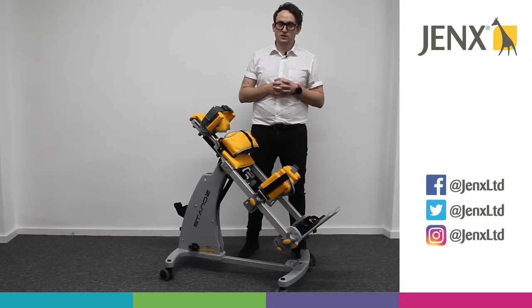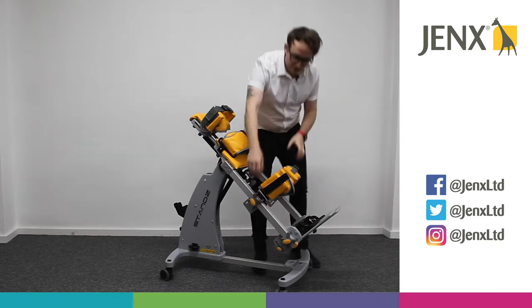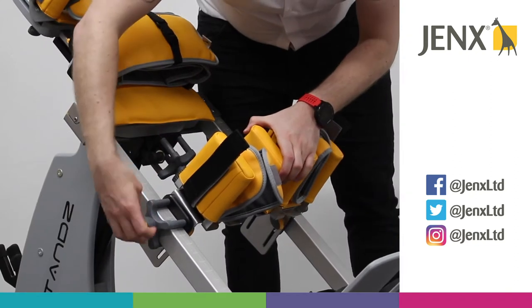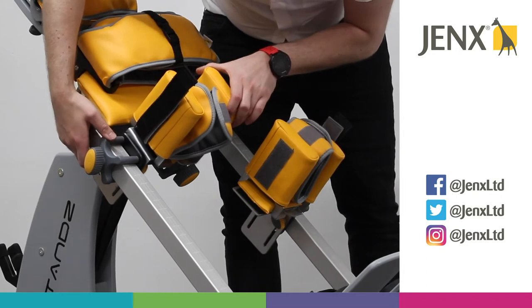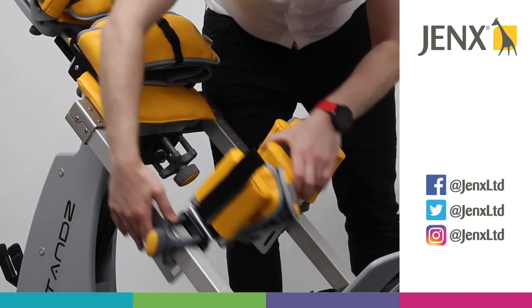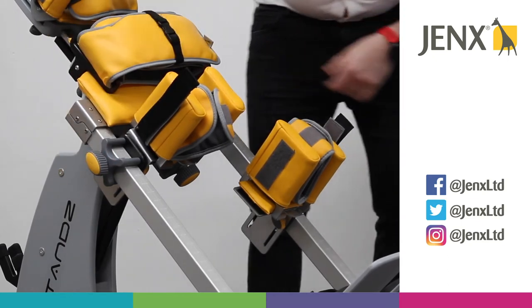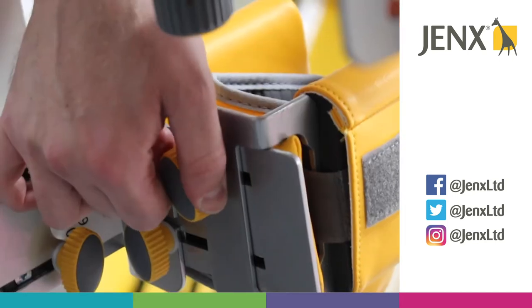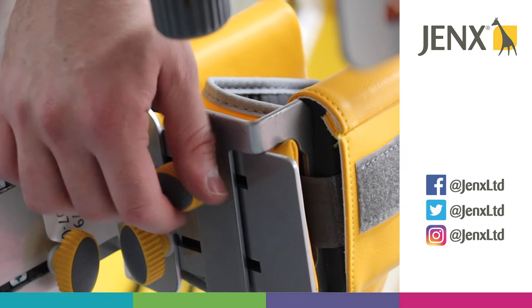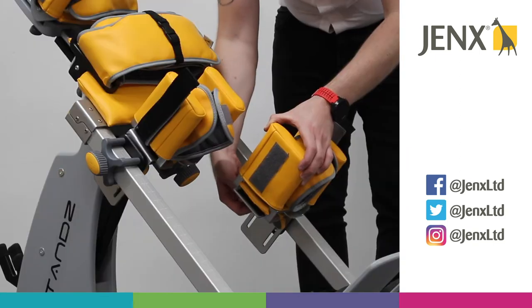If we take a look at the knee supports that we have on the frame, this is the standard knee support with the rotational control strap. If we need to move the knee supports higher, we simply loosen this wing knob and we can move the knee cup up or down. If we need to adjust the width of the knee support, we just loosen the wing knob underneath and we can widen the knee support.